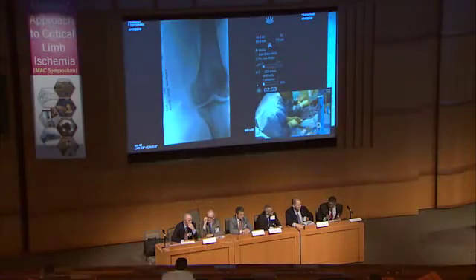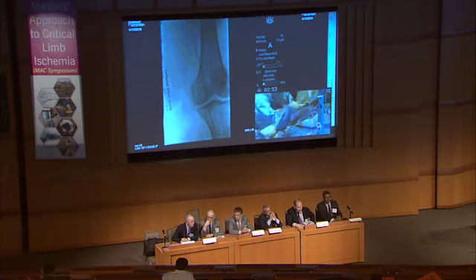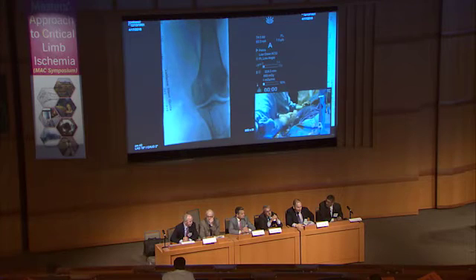Alex, these are your two questions. One short answer for imaging, and second, would you, at this point, that you have a decent result in the SFA, hopefully, go after below-the-knee vessels? No other imaging, and I completely agree with Dr. Manzi. You have to open up the outflow, lest not only do you not achieve healing, which is your goal, but you also are at risk for thrombosis of the Viabahn.